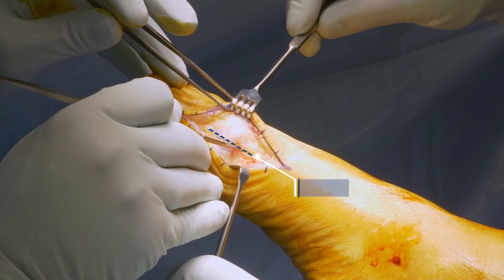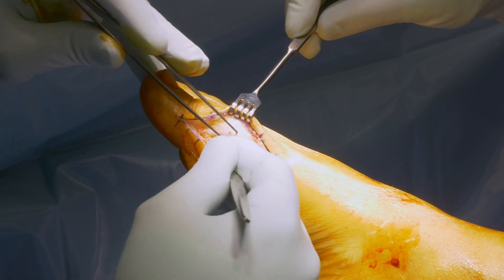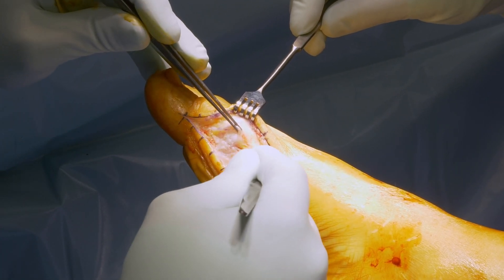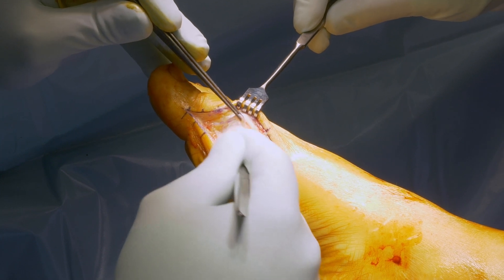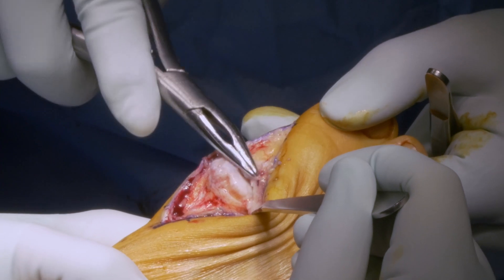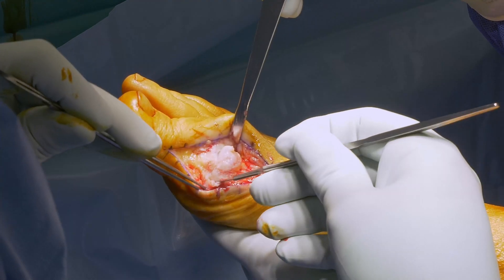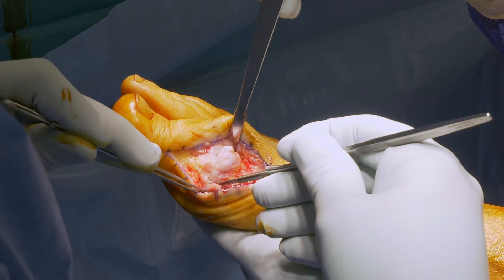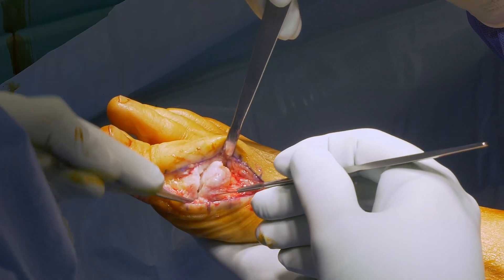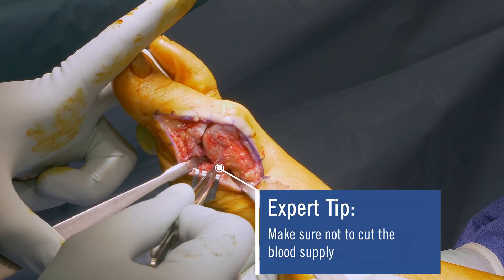A straight arthrotomy is performed and the soft tissue is prepared periosteally to the top. Mobilization and cleaning of the capsule dorsally. Afterwards, the plantar base of the capsule is identified, through which the blood supply for the whole head is coming. Make sure not to cut the blood supply.